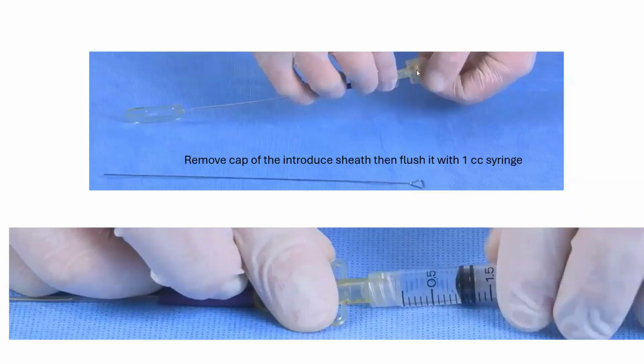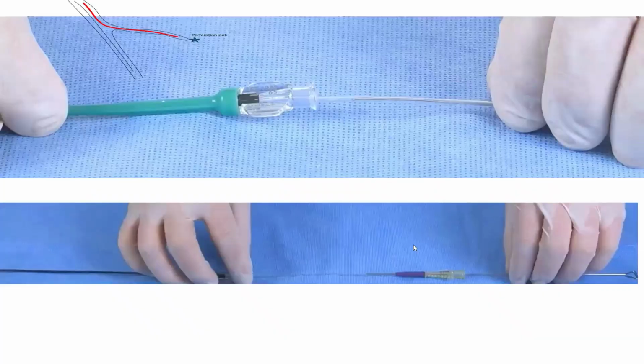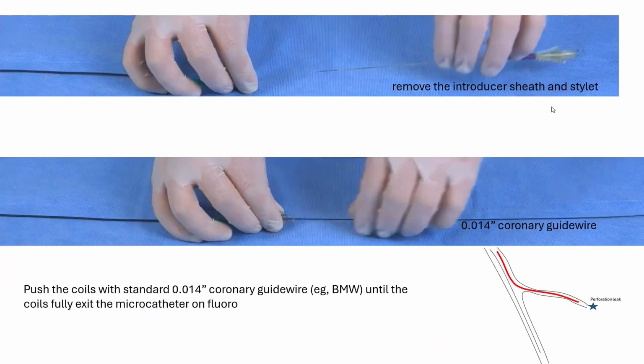So you flush that sheath, you remove the cap from the back of the sheath, you flush it, then you insert that plastic sheath into the hub of your Fine Cross that's already in the perforated branch. You insert it a couple of centimeters into that microcatheter. Then you use a stylet to push the coils from that introducer white sheath into your microcatheter. Then once those coils, those black ones here, are pushed into the microcatheter, you remove the introducer sheath and the stylet.